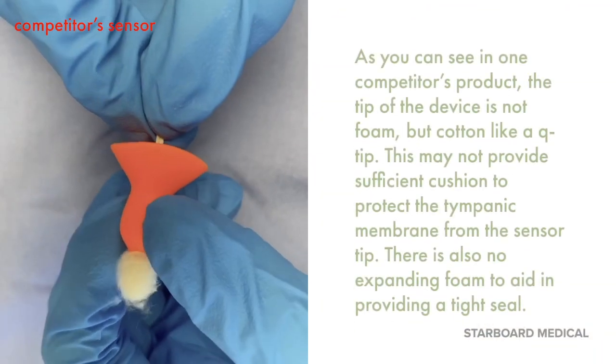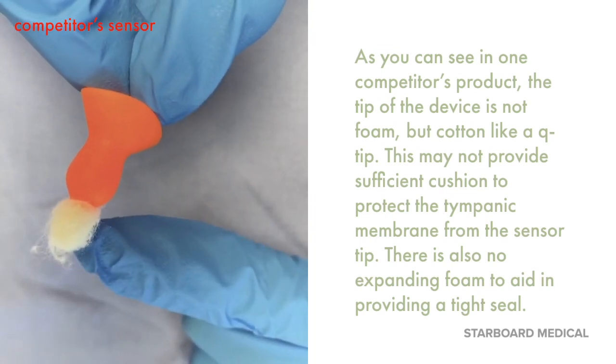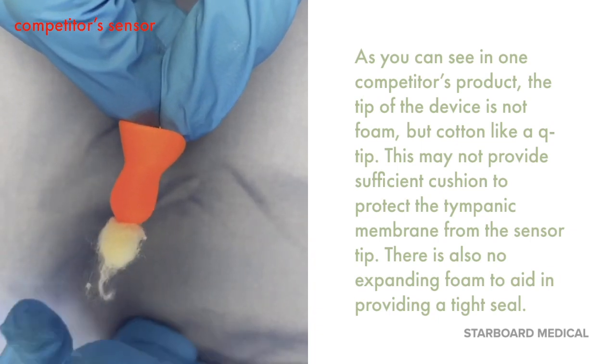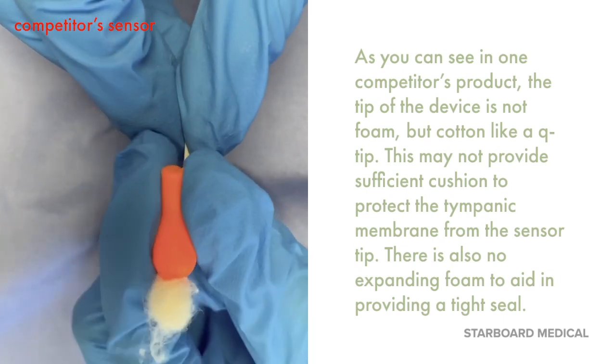As you can see in one competitor's product, the tip of the device is not foam, but cotton like a Q-tip. This may not provide sufficient cushion to protect the tympanic membrane from the sensor tip. There is also no expanding foam to aid in providing a tight seal.